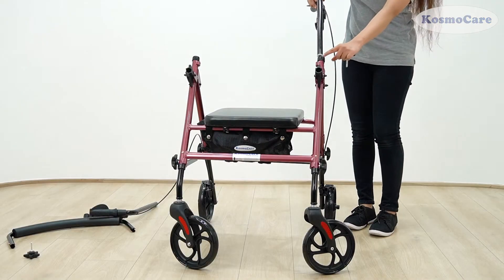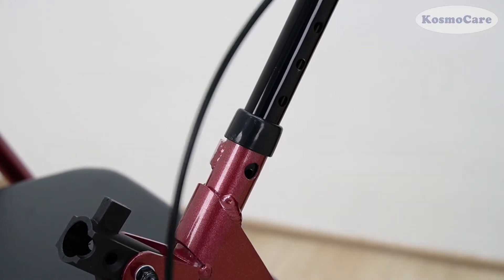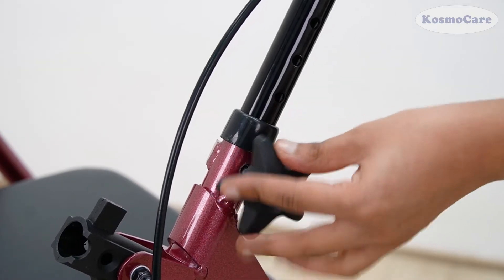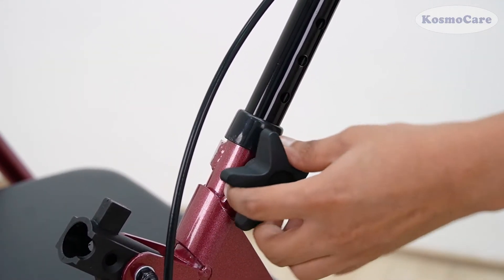Place a handlebar in each handlebar receptacle and adjust to the desired height. Insert locking knobs into adjustment holes and tighten to secure the handle in place, making sure both handles are at equal height.